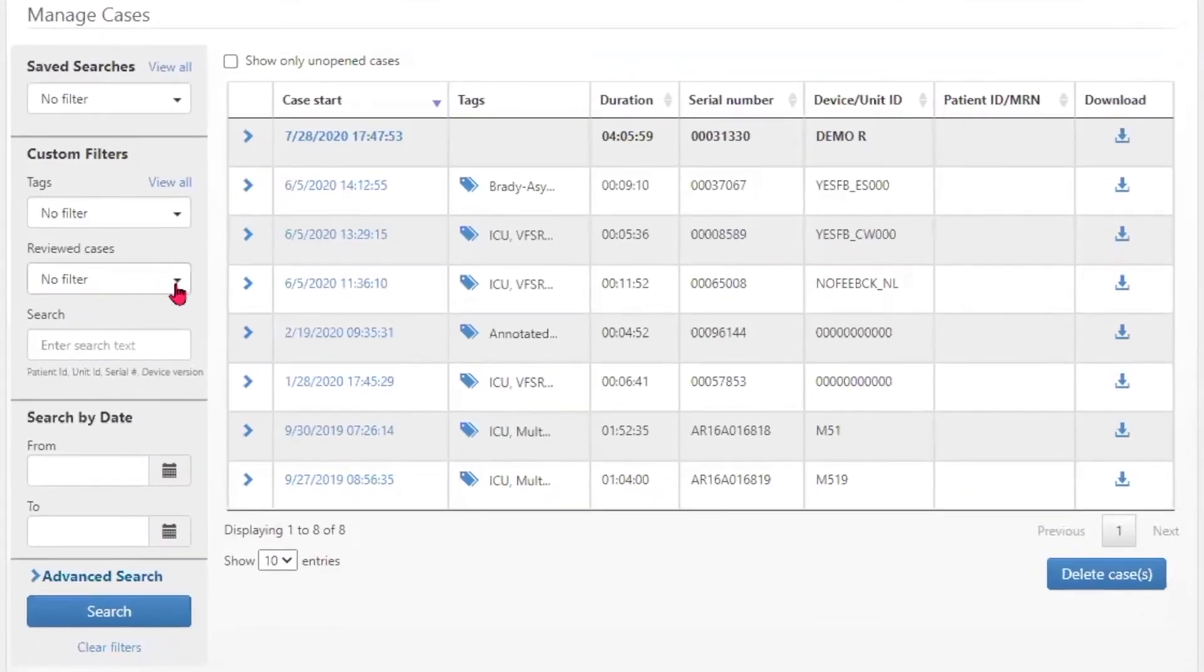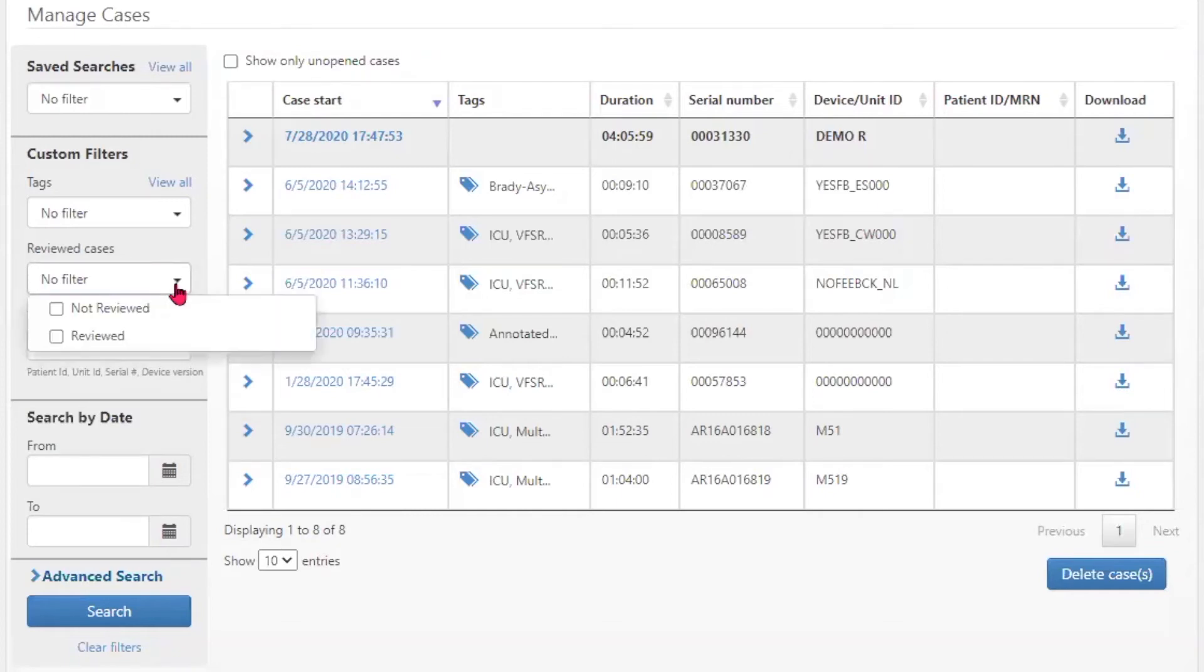Once cases have been marked reviewed on the performance summary page, cases can be filtered as reviewed or not reviewed by selecting the appropriate box on the drop down menu.